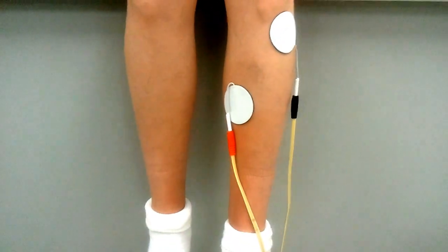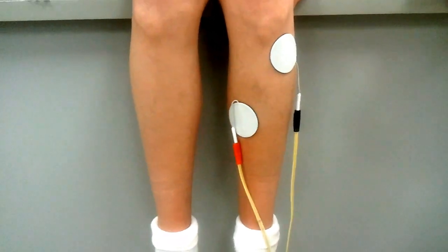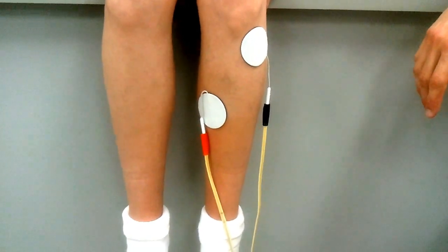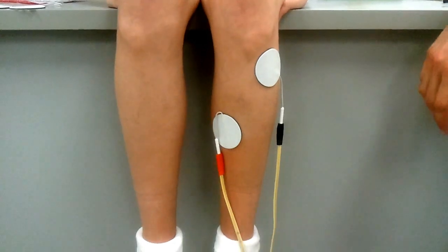When you set it up on the patient, you want the patient sitting up with their back supported. You want a towel underneath their leg and you want the leg dangling off the ground so that you're able to see the full contraction of the muscle when you turn the machine on.